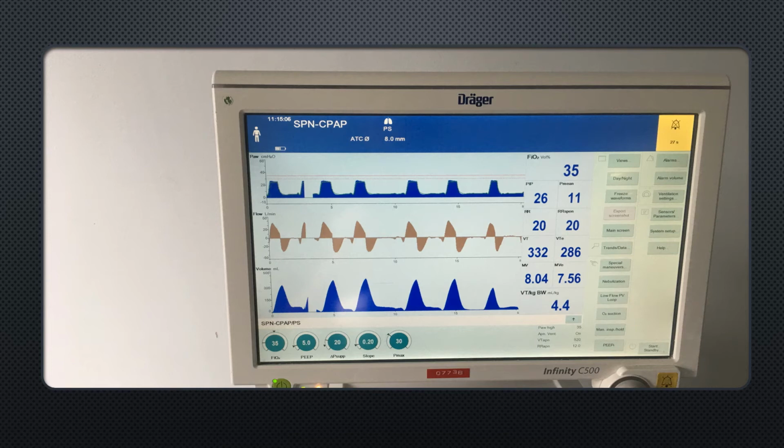To suit the respective lung mechanics, the speed of the pressure increase for pressure support can be adjusted using the slope or flow adjustment to ensure patient comfort. This is the simplest mode of respiratory support, and patients should be in this mode with minimal pressure support prior to extubation.